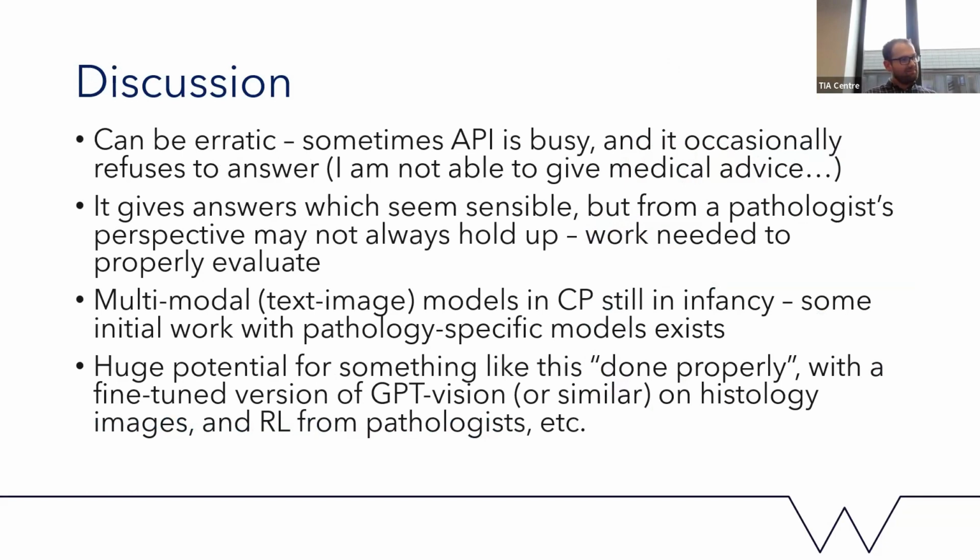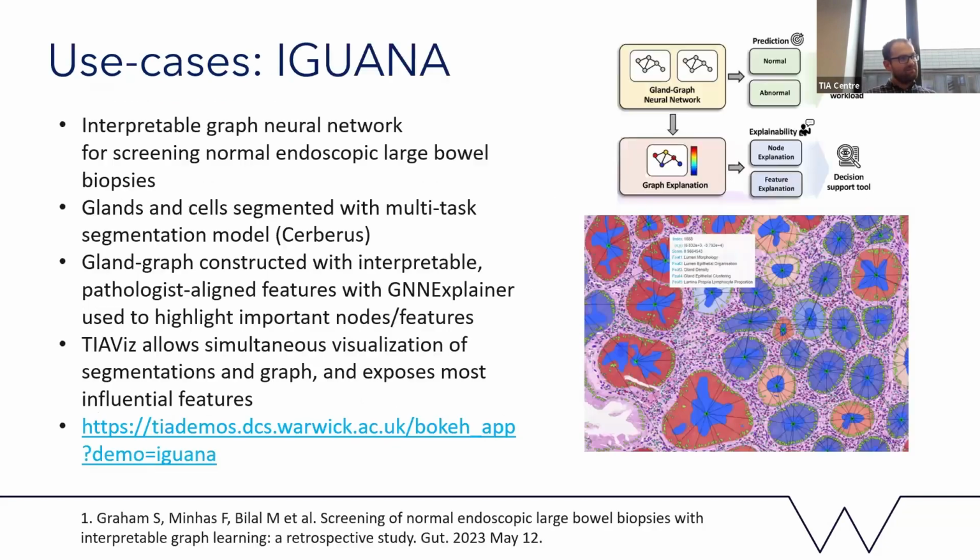Once models of sufficient quality for pathology become available. So as a last thing, I'm just going to go through a few use cases where this visualization tool has been used. For the first one, it's a method called Iguana, which was developed by Simon Graham from here at Warwick.